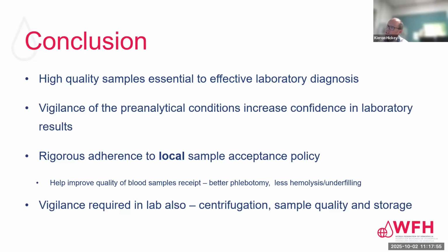that works successfully locally. And it may well involve interaction with people that may be outside your department, like phlebotomy, for example. But what it does overall, this interaction, is help improve the quality of the blood samples you receive, because you can have better quality phlebotomy, less hemolyzed samples, less underfilled samples, and the people drawing the samples have a better understanding why we have strong adherence to preanalytical conditions to help drive better quality lab results as our primary goal.